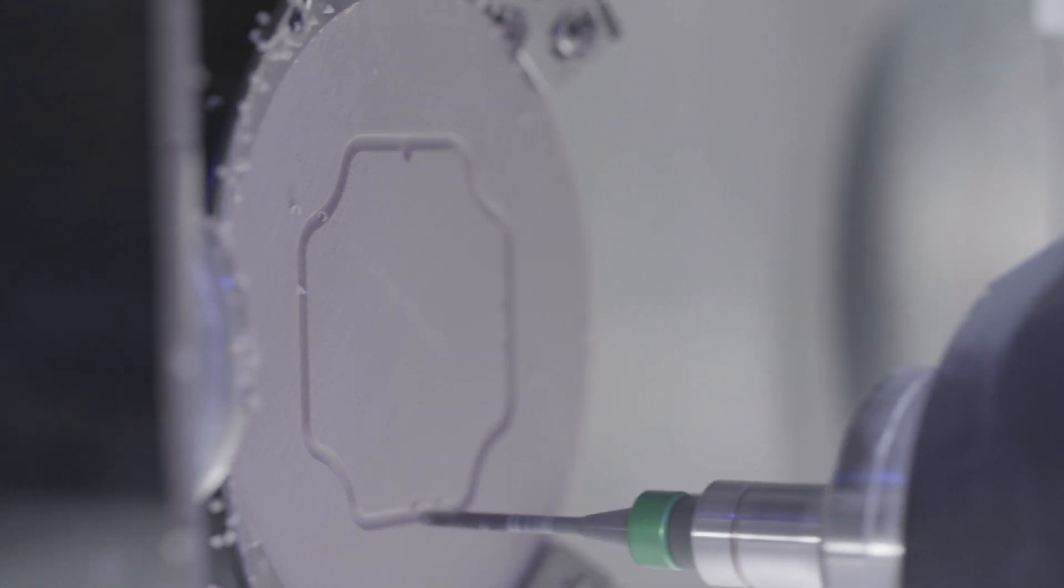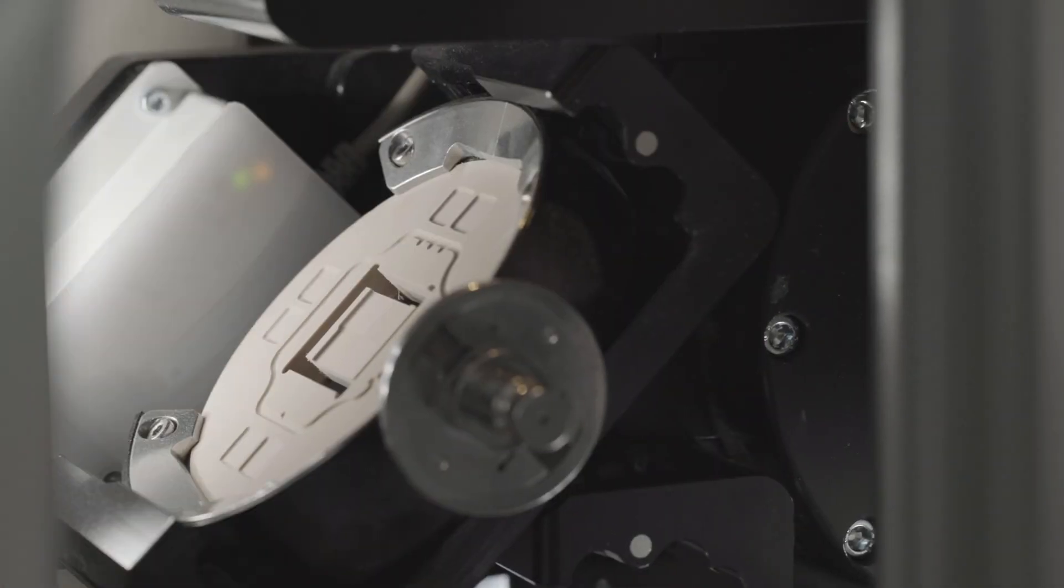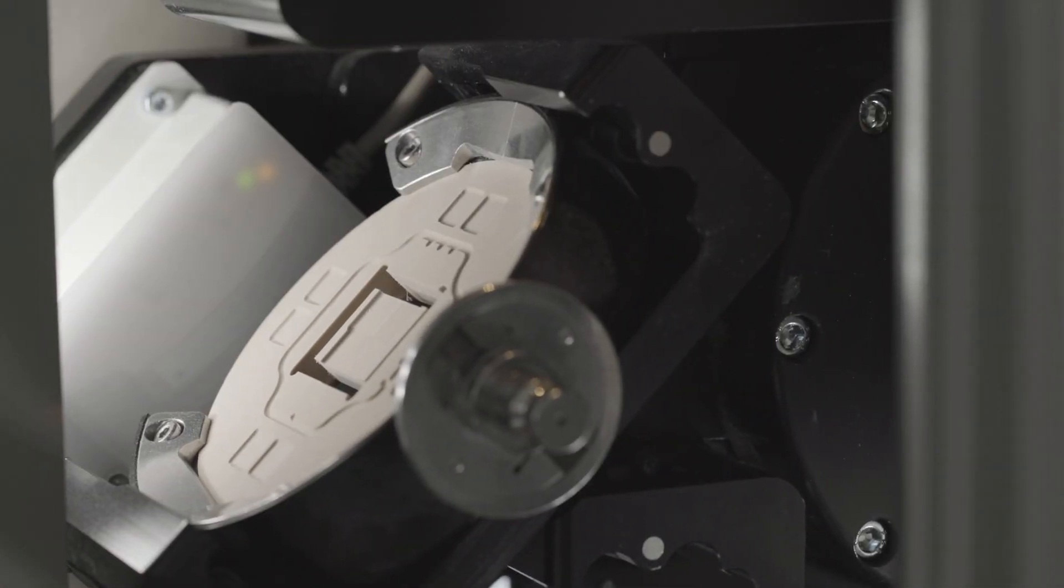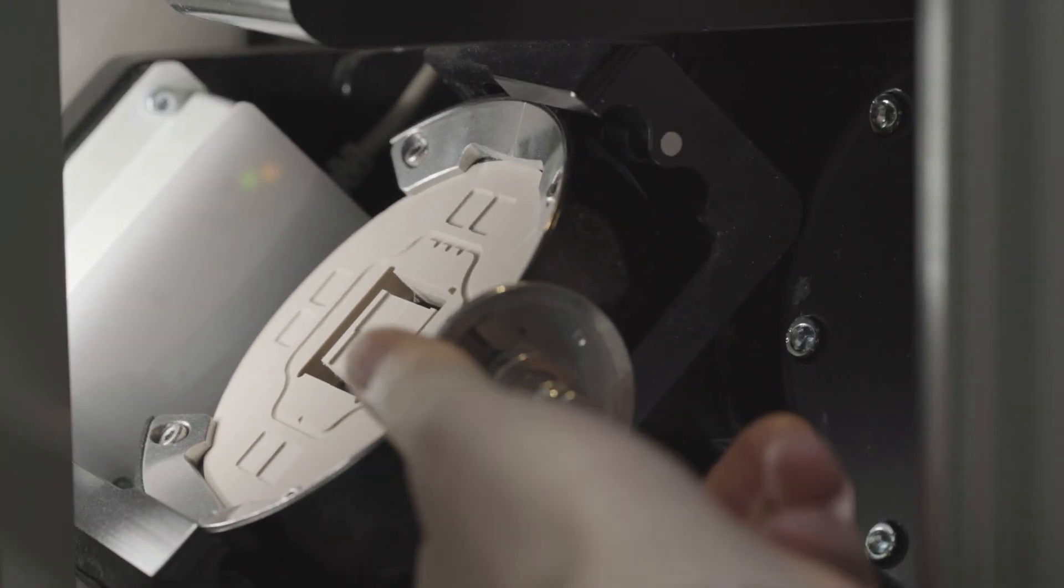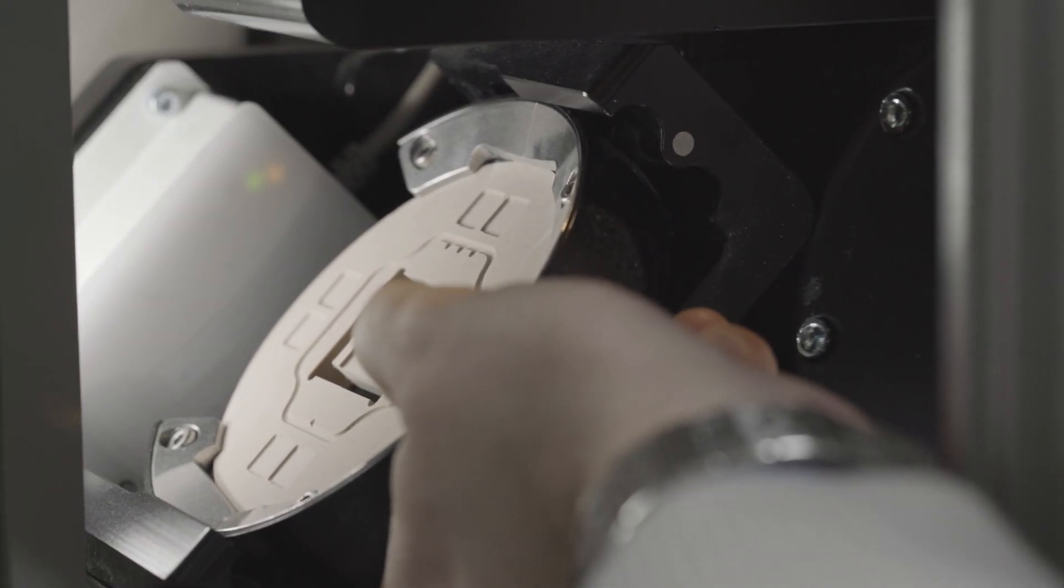When the milling job is completed, remove the test specimen blank from the material changer.